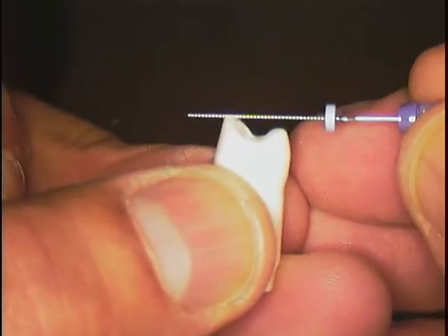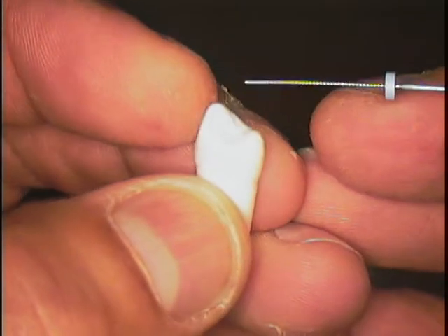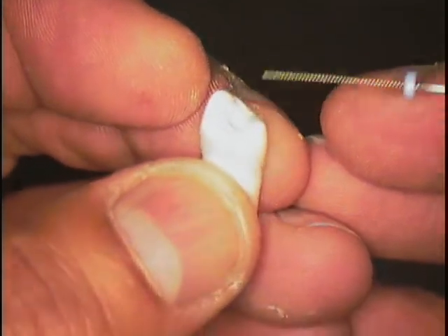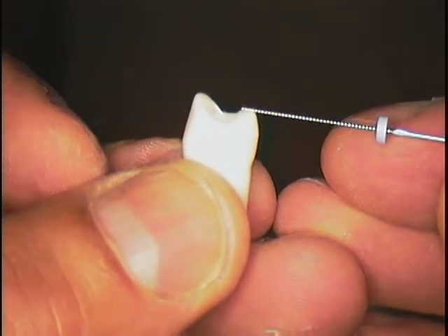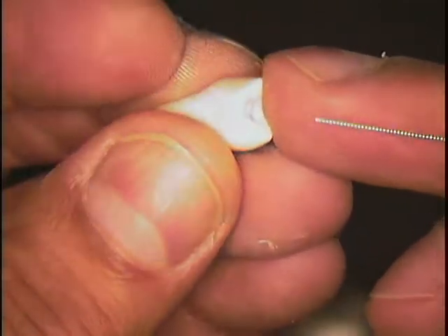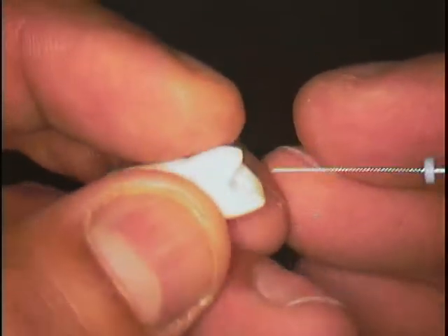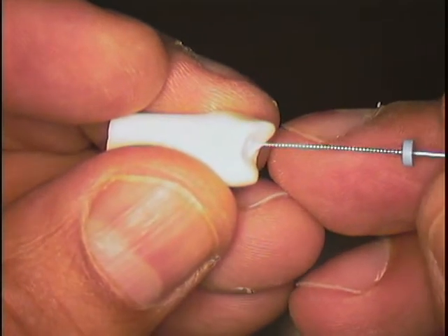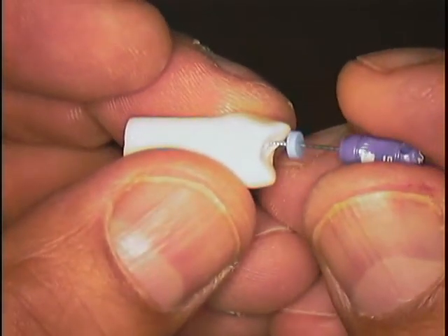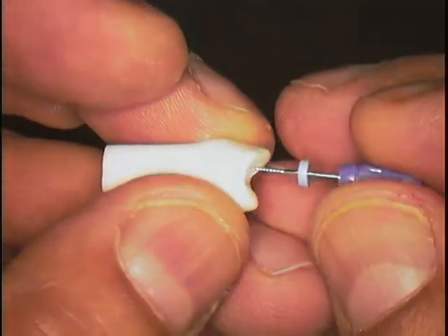All right. Take a look at your tooth first. You're going to notice that one cusp is taller than the other. So if I'm going to measure my working distance for my buccal cusp, I'm going to probably come up a little bit longer because see my lingual cusp is a little shorter, and that's the way it is in nature on tooth number 12. So the first thing I'm going to do is just push this in, and my measuring landmark is going to be my buccal cusp for my buccal canal. So I'll push that in gently, move the stopper, push it in again.